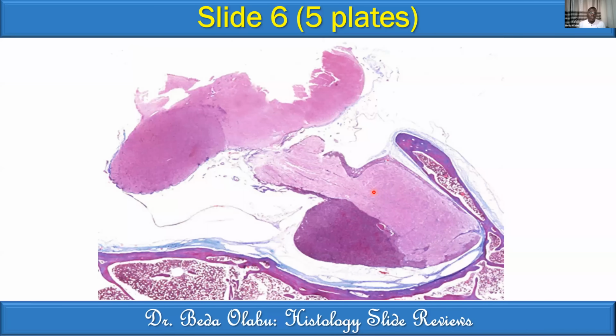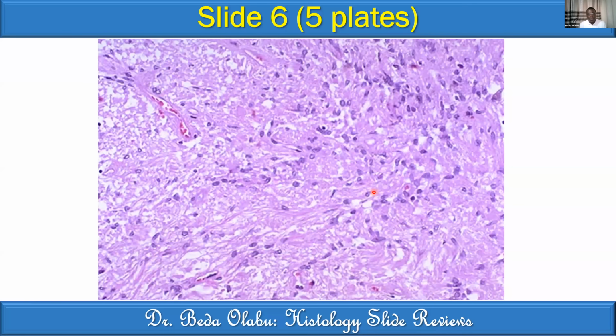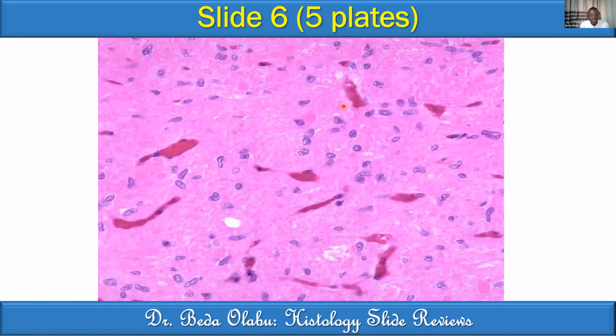So which histological features do we expect you to pick for the pituitary? The one I'm showing you right now is for the neurohypophysis. Predominantly fibrous. We see blood vessels, we see fibers, and we see cells. That is what we pick on the neurohypophysis. Maybe this one shows us still with a different stain, still neurohypophysis. I want you to pick some three things on this part.